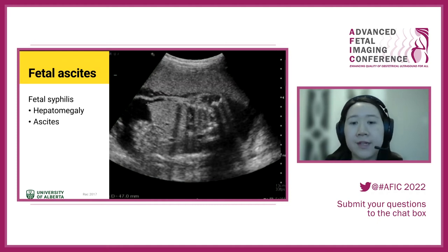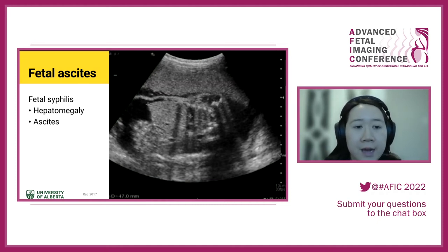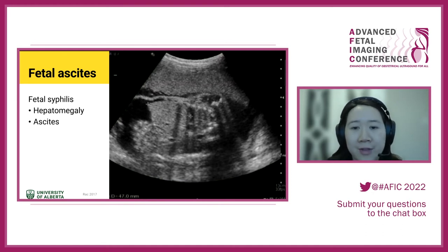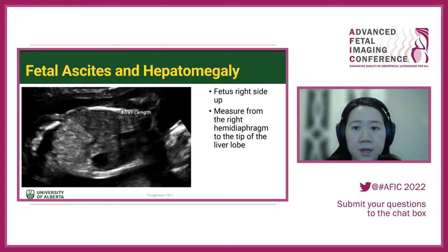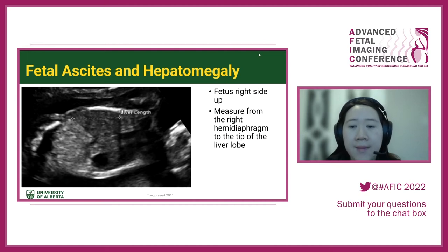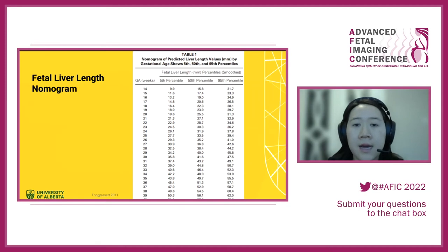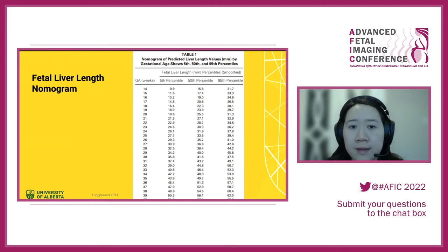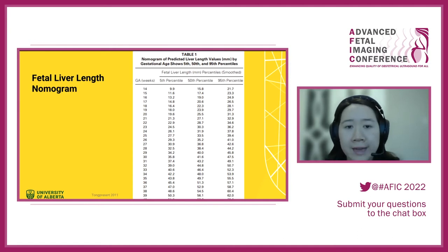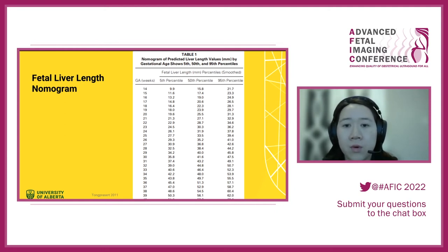This is a picture of a fetus with congenital syphilis — there's hepatomegaly and ascites. Hepatomegaly is a key finding alongside fetal ascites, so look for those other abnormalities. To measure fetal liver length, the key is to have the fetus right-side up and measure from the right hemidiaphragm down to the tip of the liver lobe. It's important to know the normal lengths in the context of fetal syphilis or fetal ascites.